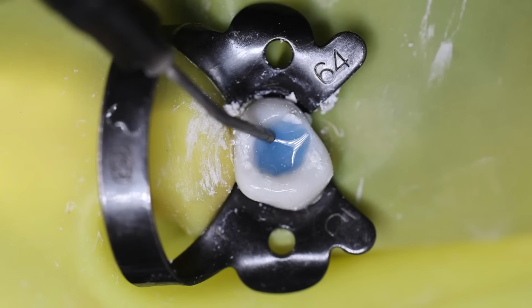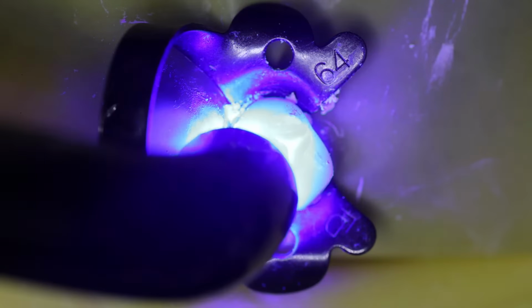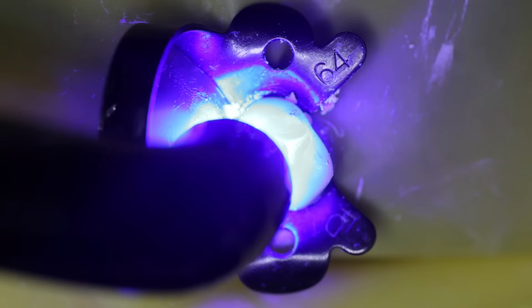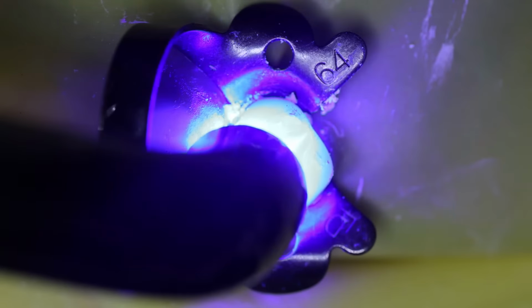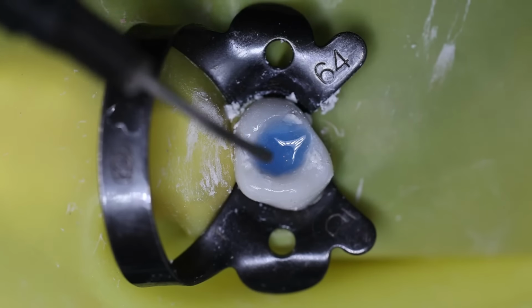So this is the second increment. Cure it. 30 to 40 seconds cure is enough. And again a third increment may be needed.